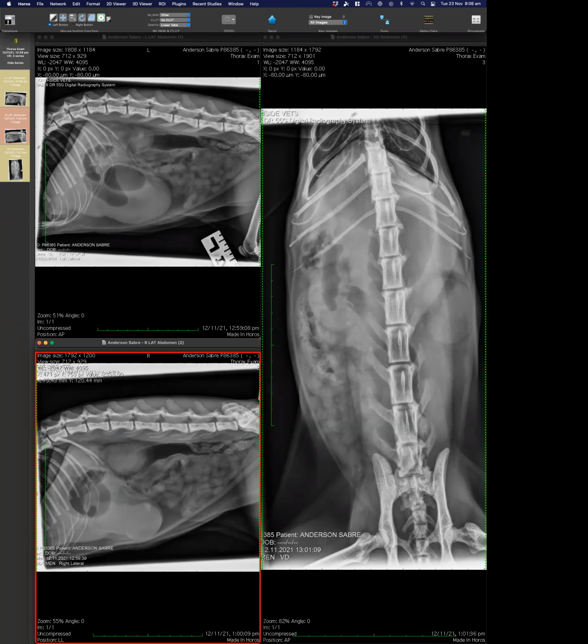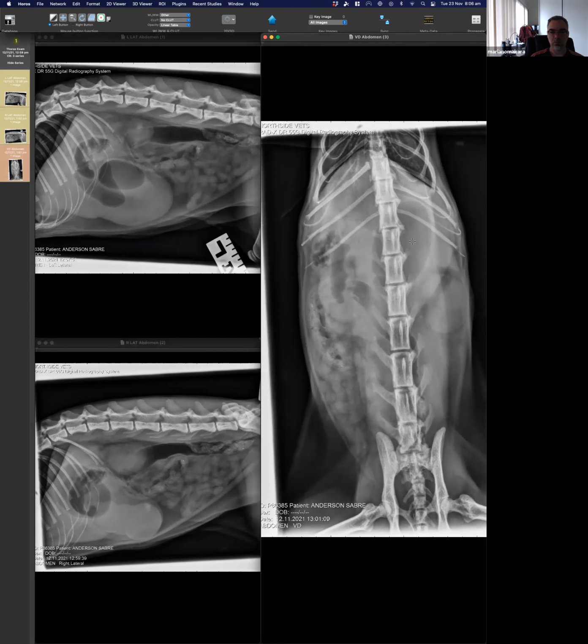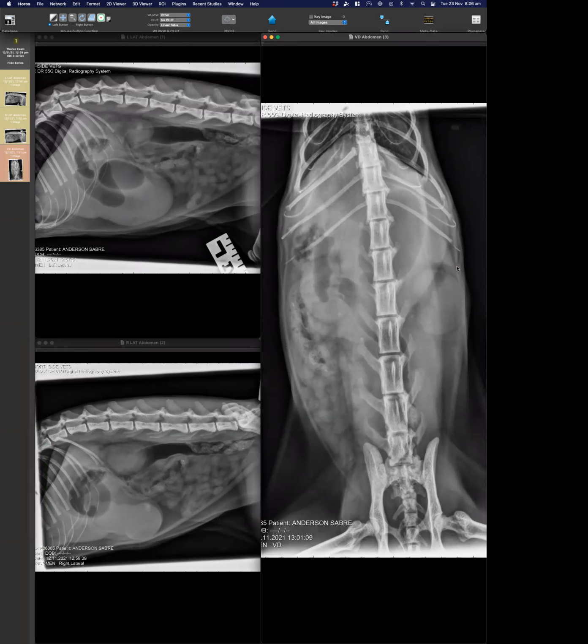There's very good abdominal detail, which is good. It looks like very good technique. I can see the colon. The radiographs are abnormal. Okay, good. I think I can see most of the colon going up and then around here. And on the VD, I think this might be colon as well, like the ascending colon potentially. I'm not sure. I'm just trying to work out what this organ is and whether it is stomach or a mass, and also where these pockets are located. That's why I haven't said anything yet, because I'm still trying to think about it.